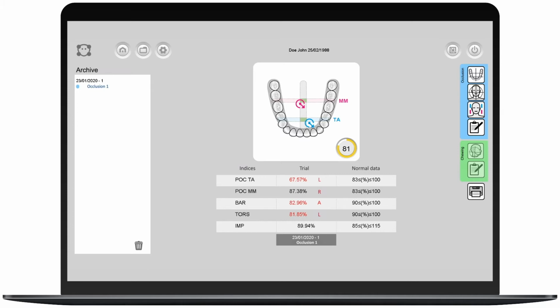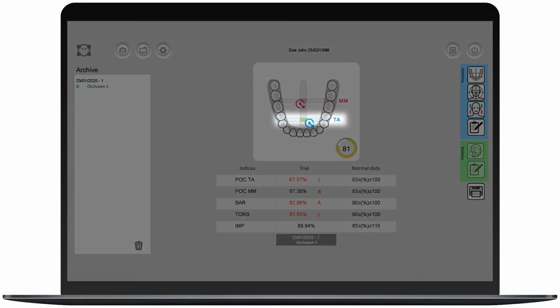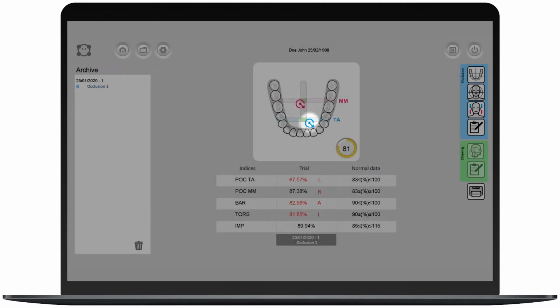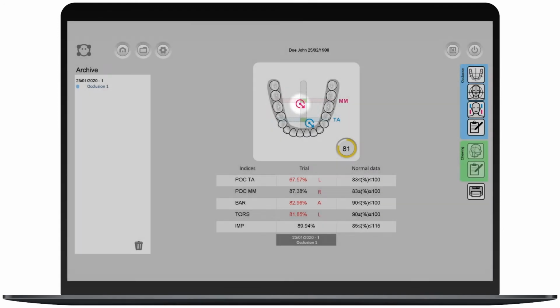In terms of representation, the temporalis anterior muscles are represented in blue and the masseters in pink. The horizontal rows in blue and pink represent the normative bands, referring to the temporalis anterior and masseters respectively. If the blue and pink symbols are in the center of the green areas, it means that everything is well balanced. A displacement of the symbols outside of the normative bands shows where the patient's muscles work more.